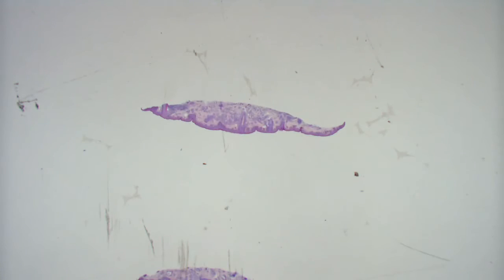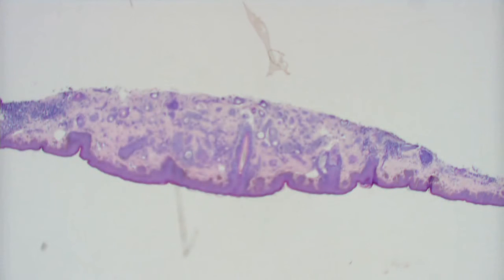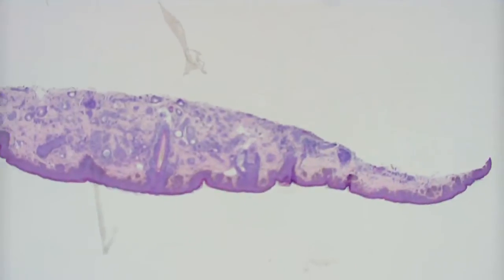All right, 137. Shave biopsy on ankle skin. It looks like a darkly pigmented center with some pigment all across the basal layer of cells. On low power, I thought this was a tadpole differential or paisley tie differential. And so I went with syringoma here. Good. So this is a syringoma.